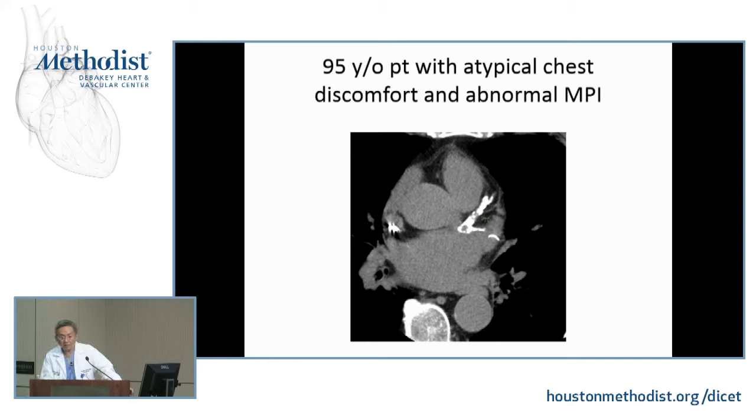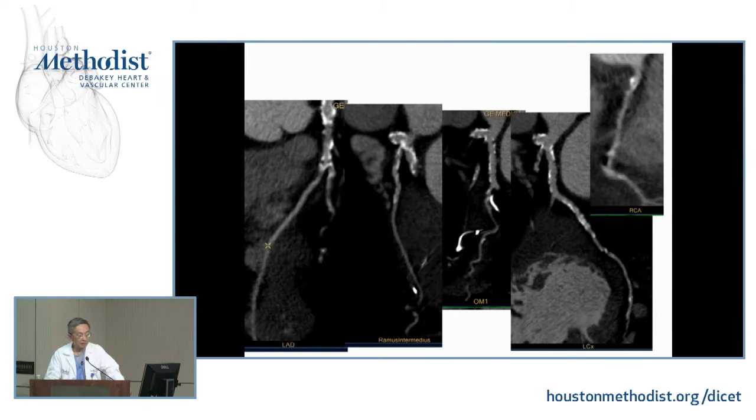It's like a Toyota Corolla compared to the Porsche that we have. It works, it gets you where you want to go. And actually, I know you all complain about West Houston not doing a good job, but this is not a bad study, right? Considering the degree of calcification, and this is after adjusting the windows, sharp filter, and so on, using all of this.